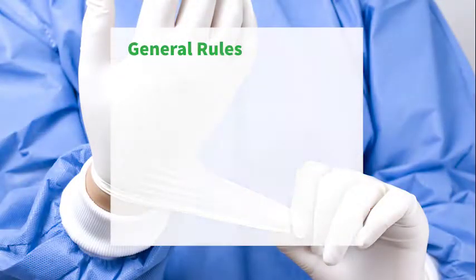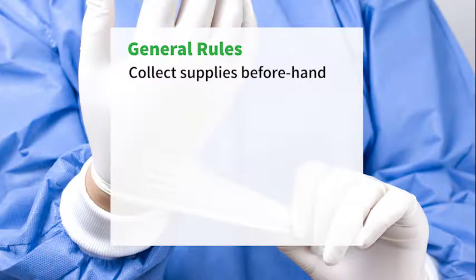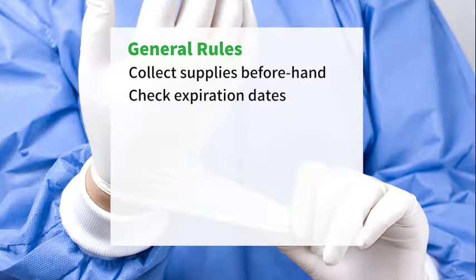First of all, let's collect our supplies beforehand, and we also need to make sure that we're checking any type of expiration dates that are on products. We certainly don't want to use something where the date is expired, and by the time we're already into this process having to step away, because then we do risk the process of contaminating what we are working on.